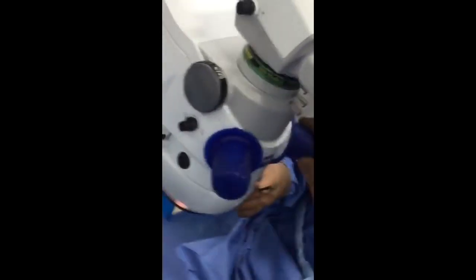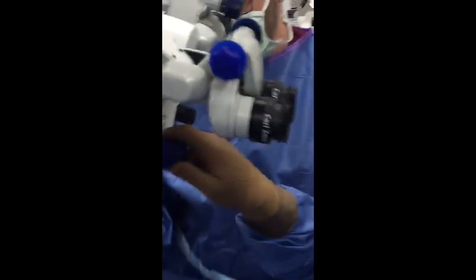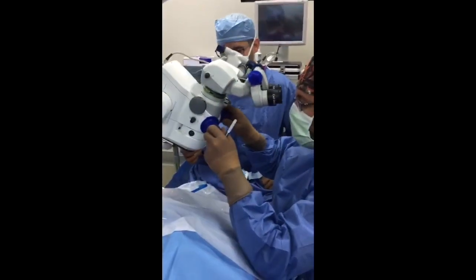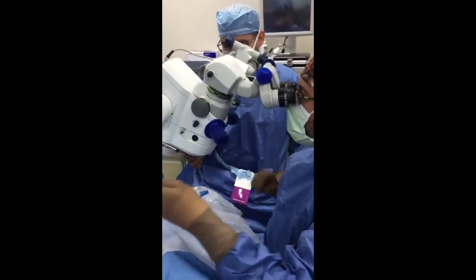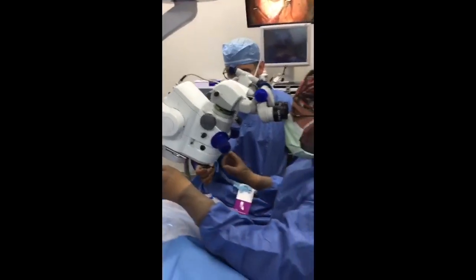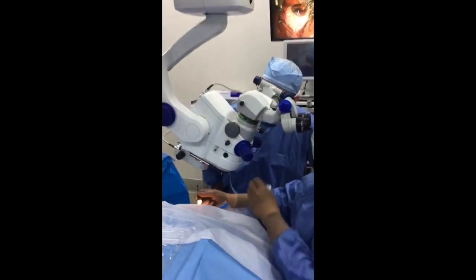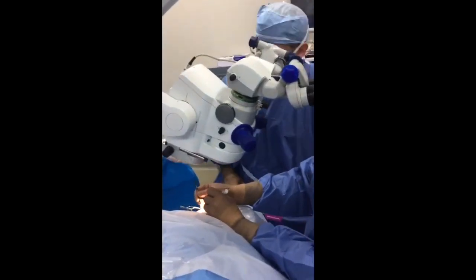The iTrack is then placed into the anterior chamber and then secured to the patient's forehead or close to the nasal bridge. The patient's head is also tilted away from me, and you can see that I'm tilting the scope towards me in typical angle-based surgery fashion. This allows us to get a good view of the angle, especially using a gonioprism that's floated over the cornea.